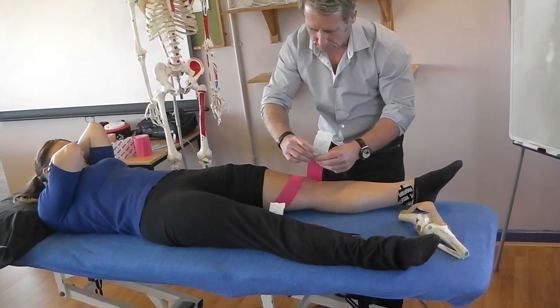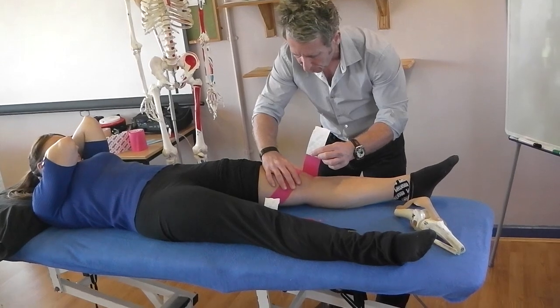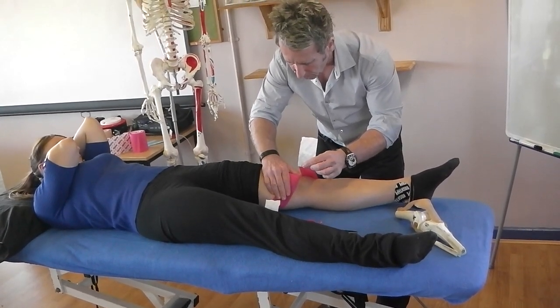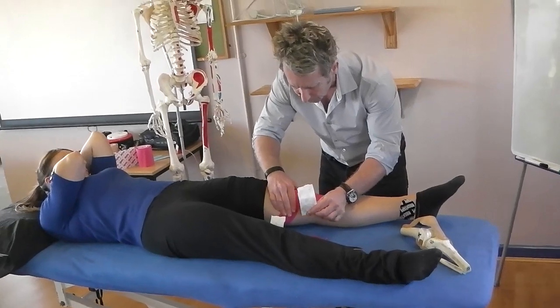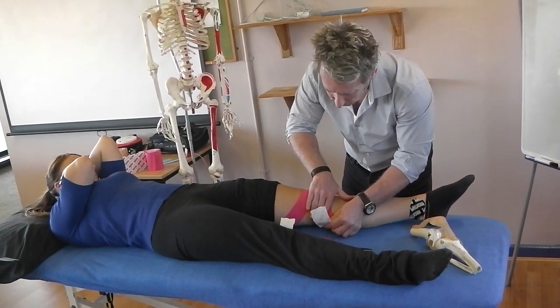I'm going to do the same again. Using my thumb on the inferior pole of the patella, push it medially. Increase the tension of the tape to 50 to 75 percent and bring that down laterally as well.